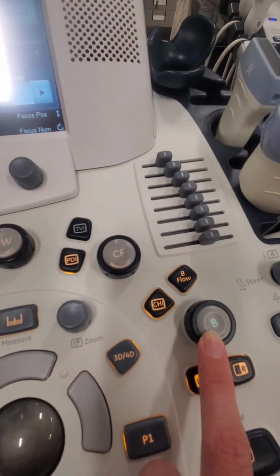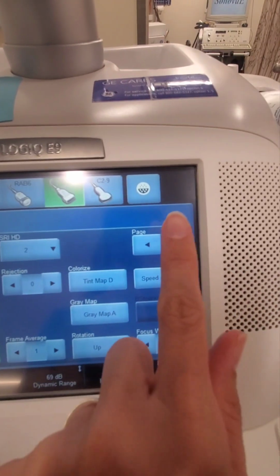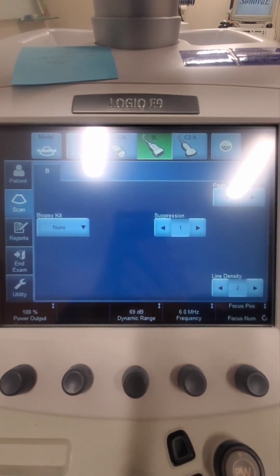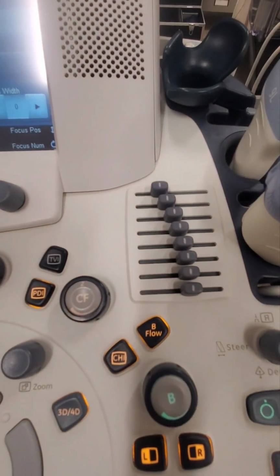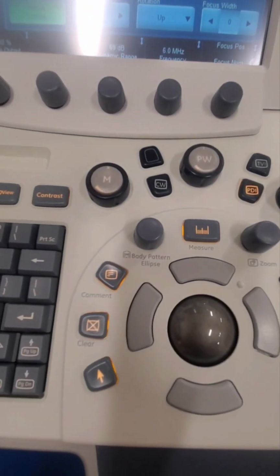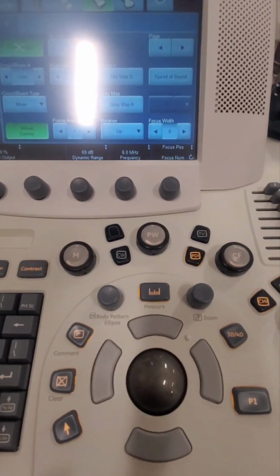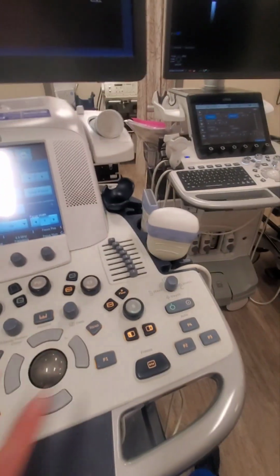So we're going to be in scanning. I have B mode, or basic grayscale. B mode, this is our options. We can page over, and we have more options. We also have things to adjust here, things we can do here. We can measure, we can change our annotations, lots of stuff, okay? Now, scanning. I'm gonna show you what these modalities do.